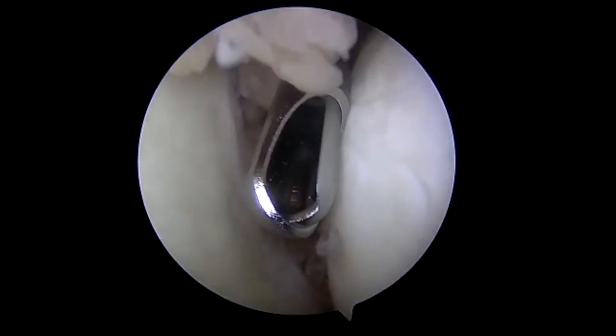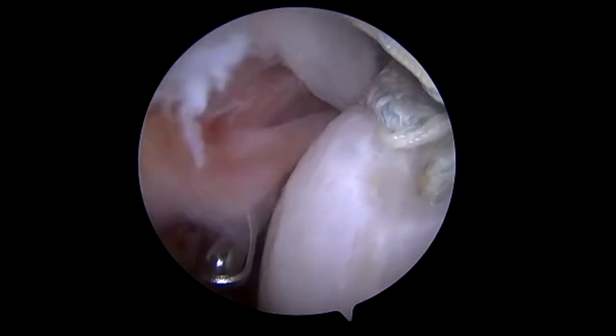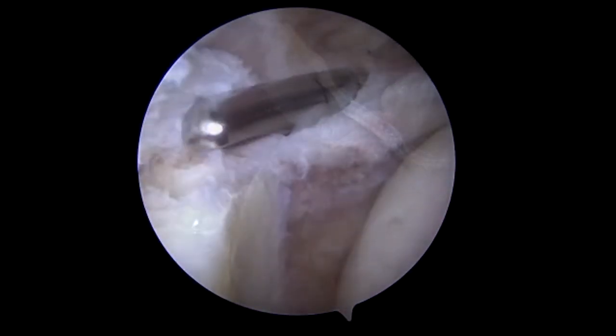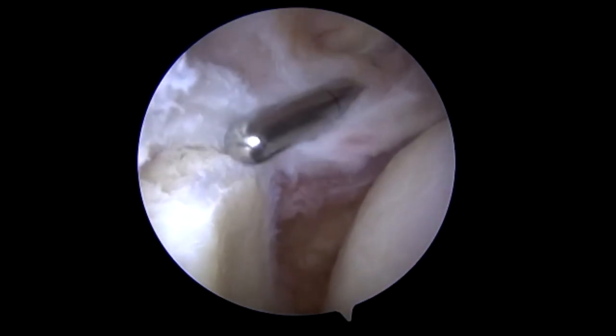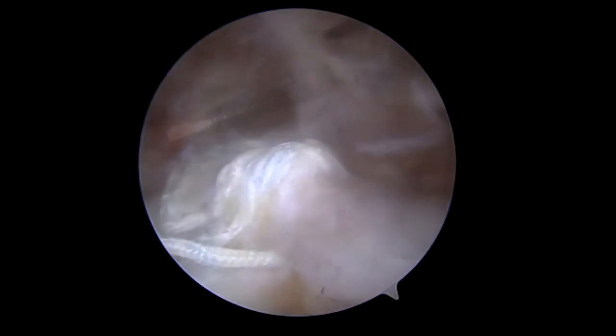Looking from the posterior portal, we immediately see a great deal of synovitis and the previous sutures from the failed repairs. We will now debride aggressively so that we can identify the superior glenoid.